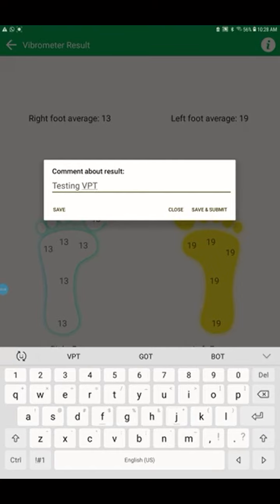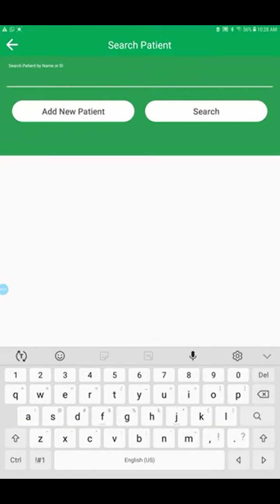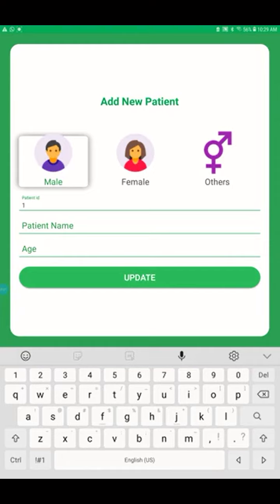Okay, save and submit. Now it is asking for the patient details. Suppose you have already done a few patients, and you have the data with you like patient ID, name, then you can search and apply the ID or the name, then it goes to him. Otherwise, if it is a new patient, then type new, select the sex. The device will automatically keep adding 1, 2, 3 like that, the ID. But there are many hospitals that maintain unique patient IDs. So in that case, you just overwrite it with the ID.